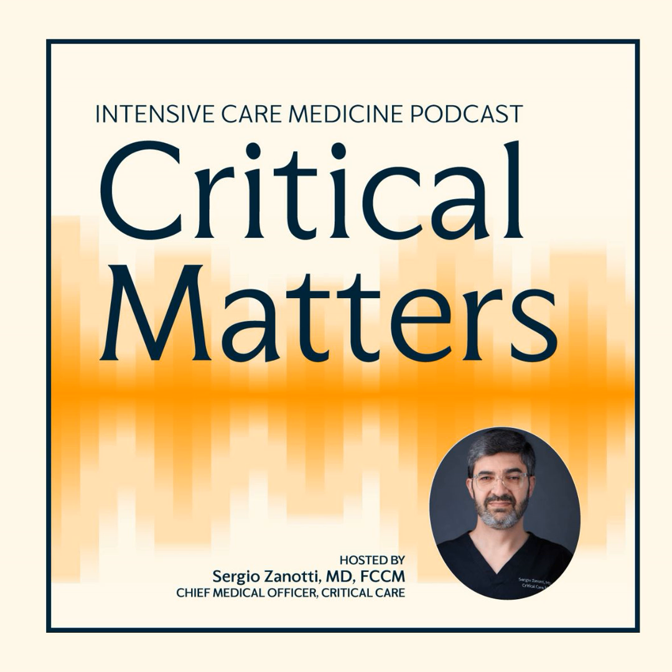And I think that if you think about what you're saying in the narrative here, most people listening to this podcast are probably in cardiac arrest 1.0, and the technology is the stethoscope, which is over 200 years old, and their fingers, which are, like you said, very non-sensitive. It's a humongous upgrade if we can do it right with transthoracic point of care ultrasound. And it seems that would be cardiac arrest 2.0. And what you're really talking about is cardiac arrest 3.0, which is using the transesophageal probe, which is becoming smaller and cheaper and more available very quickly. And that really minimizes interruptions and provides guidance in terms of what we today understand to be perhaps the most important intervention in a cardiac arrest, which is proper CPR. So it sounds like that really is the future for a lot of our patients.